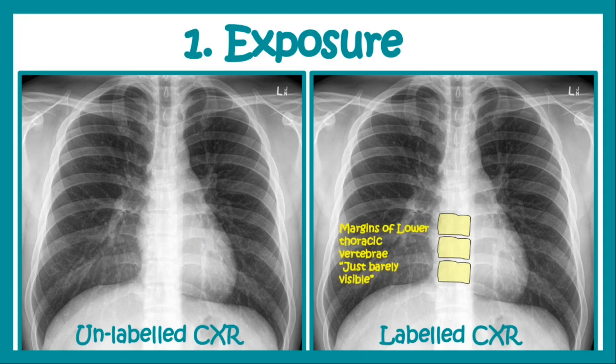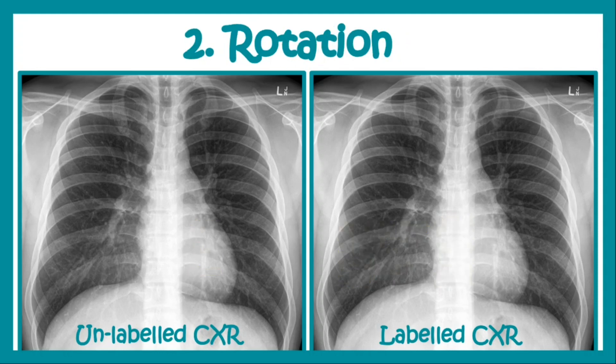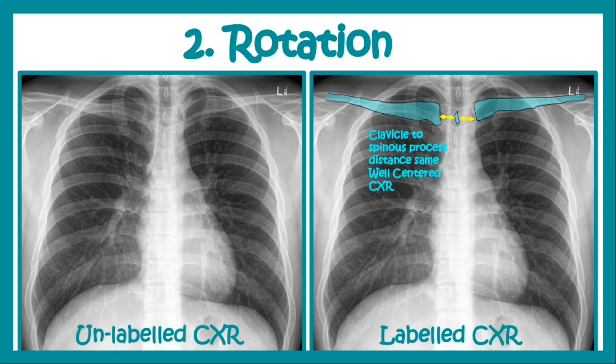Then we go for rotation. During clicking the x-ray the patient should be aligned properly and there should not be any rotation. To check for rotation we first identify the clavicles and identify the spinous process of the vertebra just at the level of the clavicle. Then we determine the distance between the spinous process and the clavicles on both sides. If the distance from the clavicle to the spinous process is the same on both sides, it is indicative of a well-centered x-ray; if not, there is some degree of rotation.